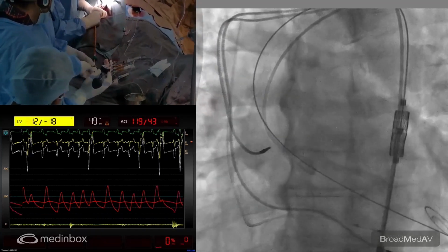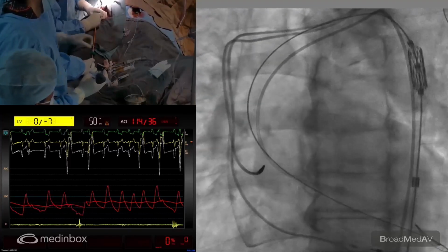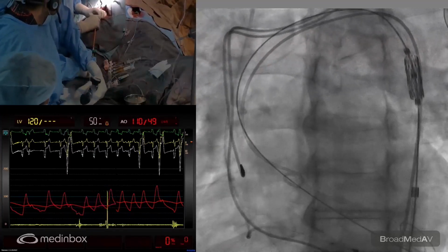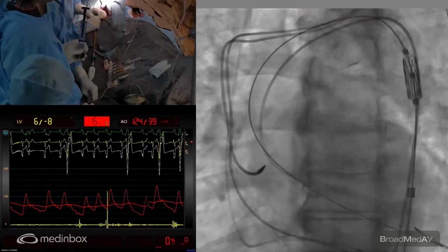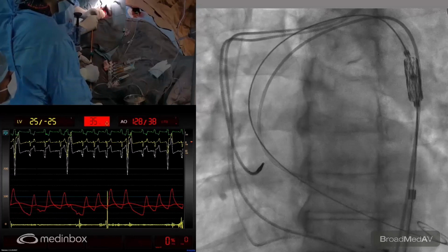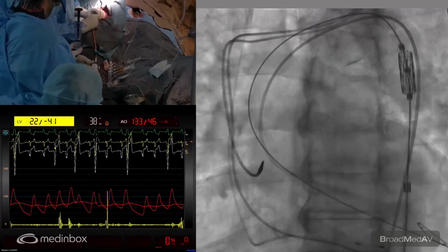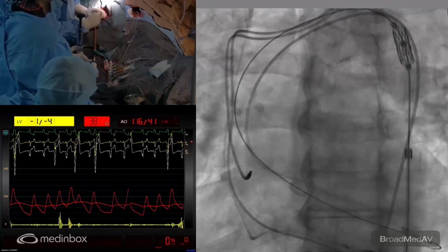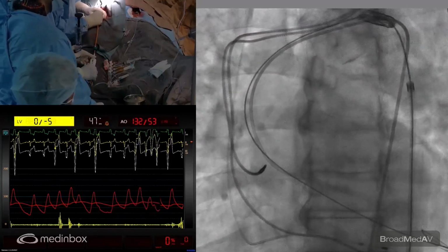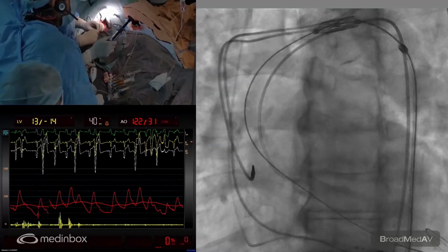And Nanda or Ashish, please flex the, so if somebody can show the hand flexion, just the wire flexing will be easier. All right. So yes, which is going to track down the ascending aorta. So you can see we're slowly flexing down so that the valve now easily tracks through that curve.